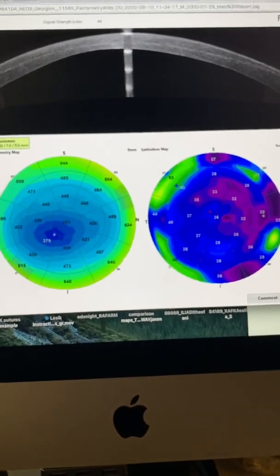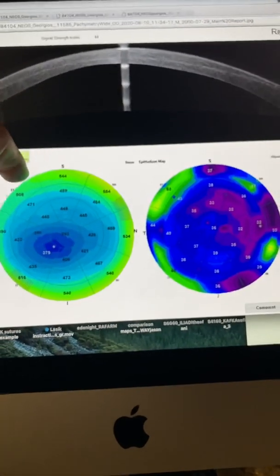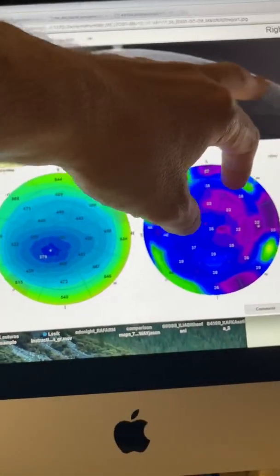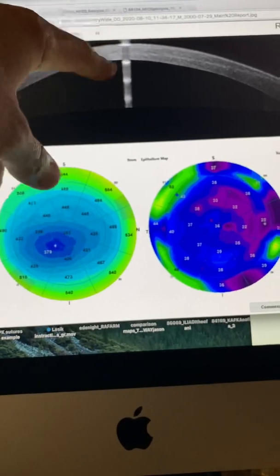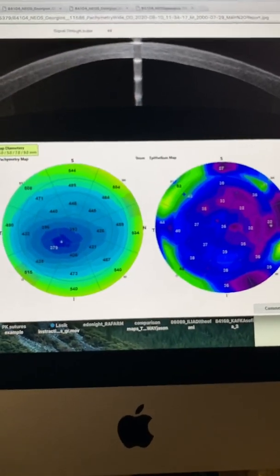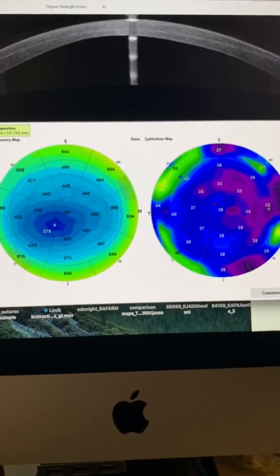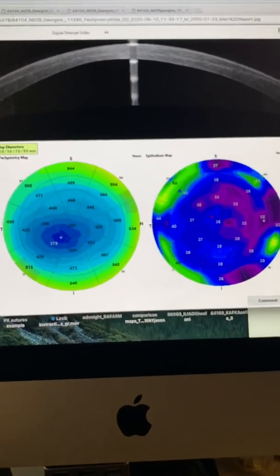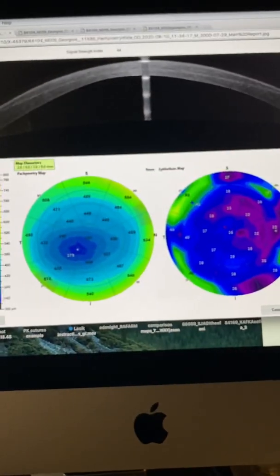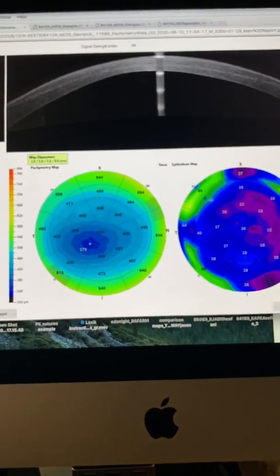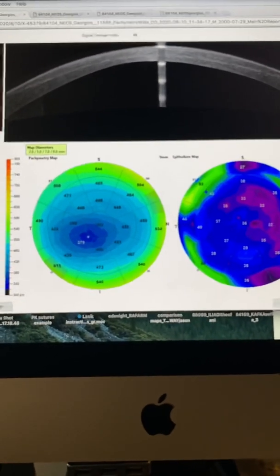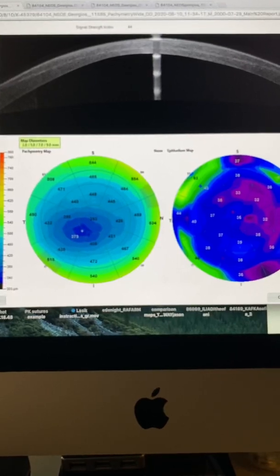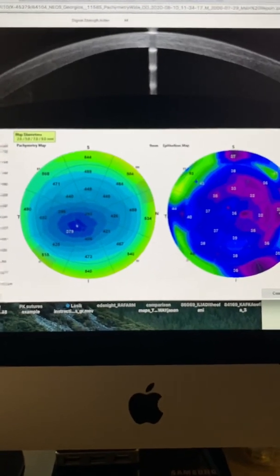But the great news here is the cross-linking line. See how deep and how wide it is. It's 67% cornea depth.